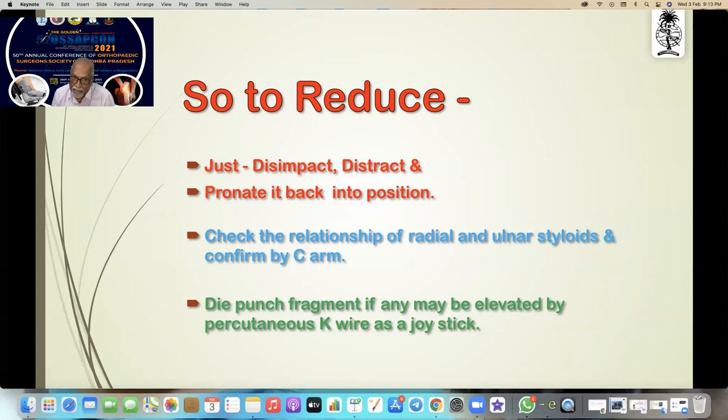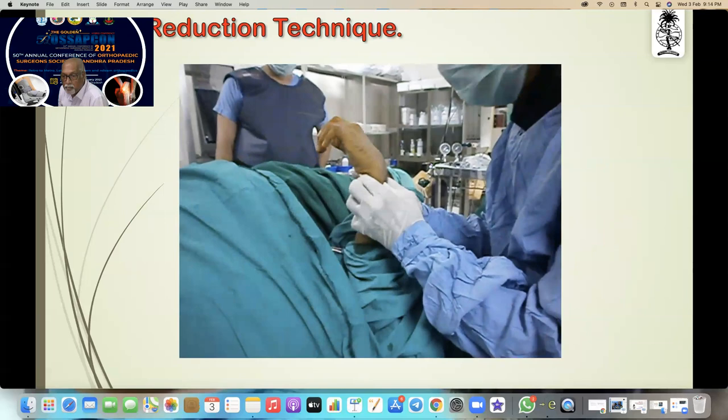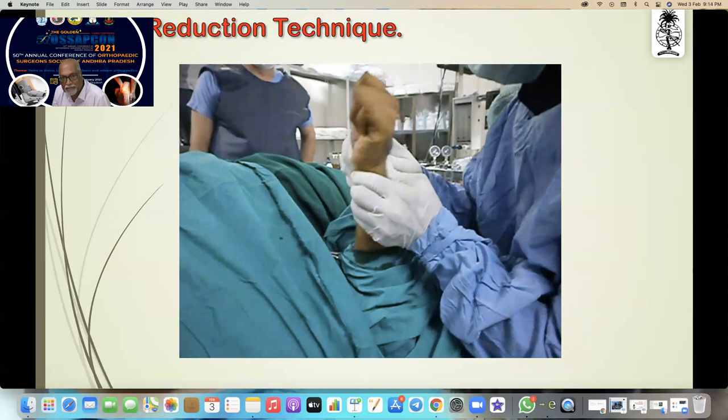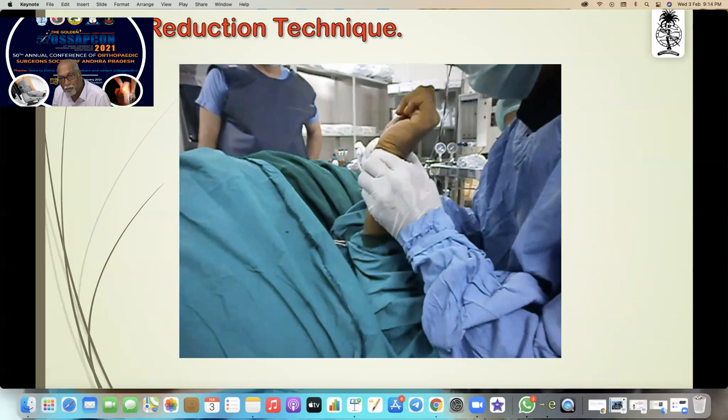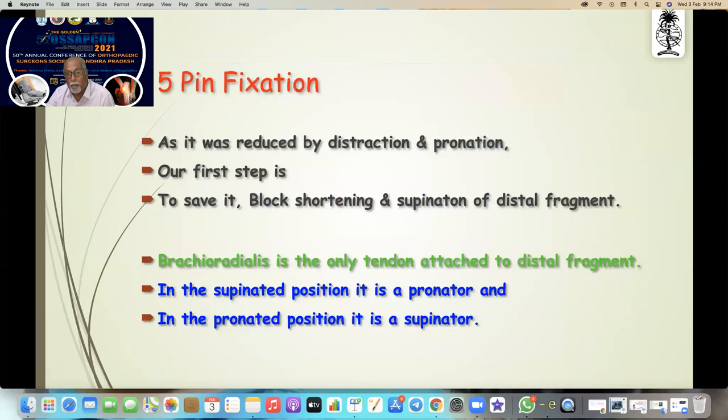To reduce, you just have to distract it, and pronate it back into position. Check the relationship of the radial and the ulnar styloid and confirm it. A die punch fragment if any may be elevated by percutaneous K-wire as a joystick. I am just distracting and reducing — that is the only manipulation you need.